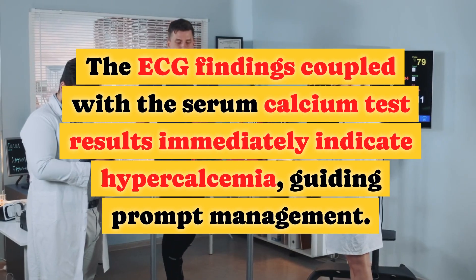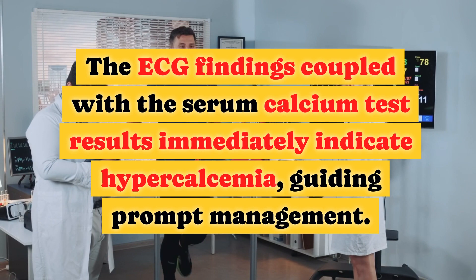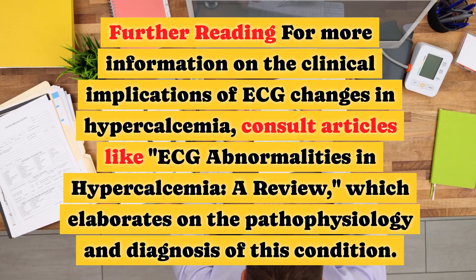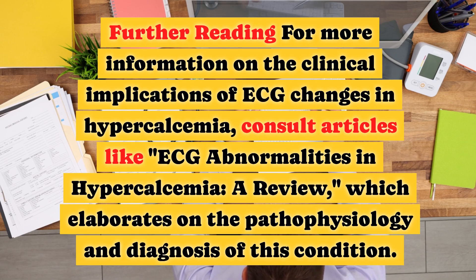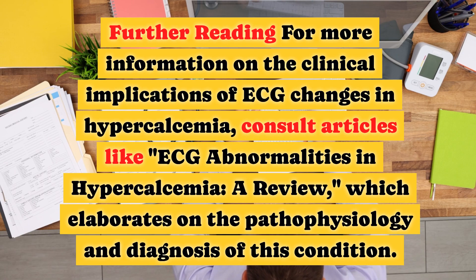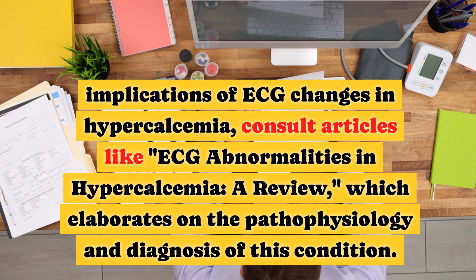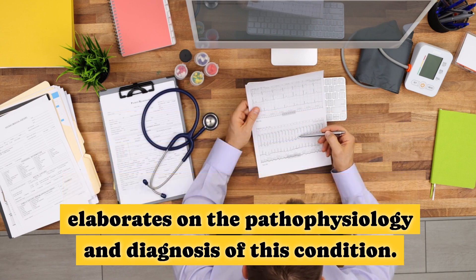The ECG findings coupled with the serum calcium test results immediately indicate hypercalcemia, guiding prompt management. For further reading on the clinical implications of ECG changes in hypercalcemia, consult articles like 'ECG abnormalities in hypercalcemia: a review,' which elaborates on the pathophysiology and diagnosis of this condition.